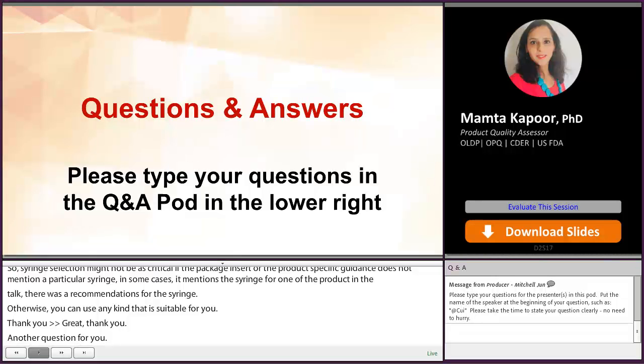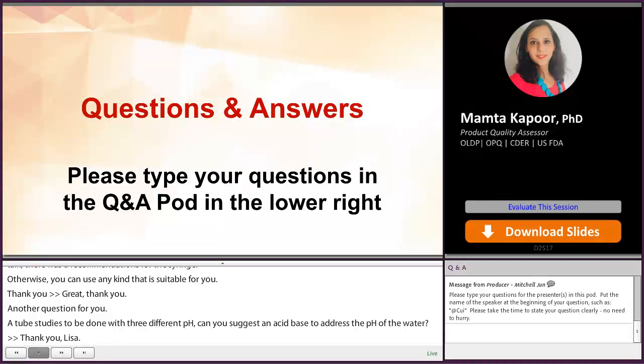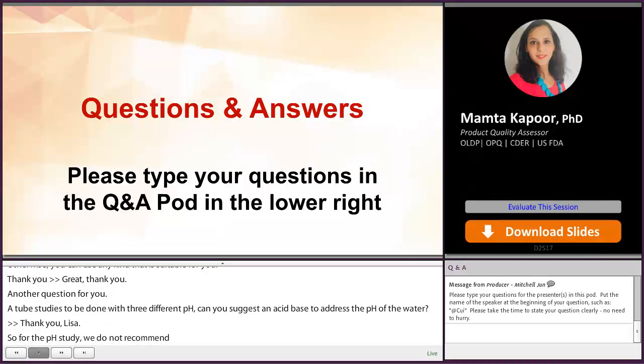Thank you, Lisa. So for pH study with tubings, we do not recommend the use of buffers just because we want you to mimic the clinical conditions in the clinical setting. So we do suggest that you do the pH adjustment using acid or base. That's how we want you to do it instead of using any buffers. Thank you.